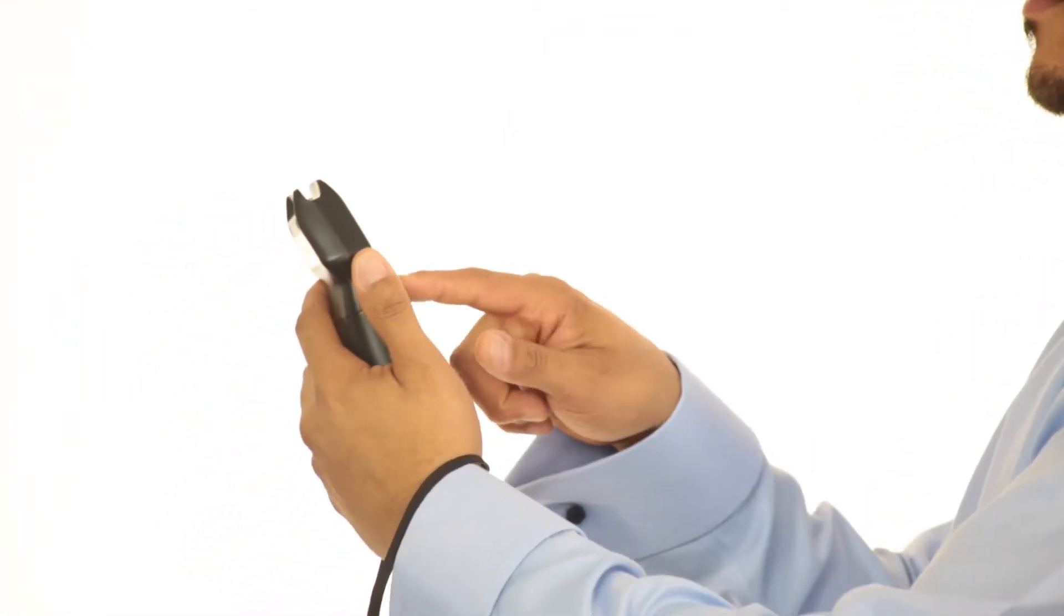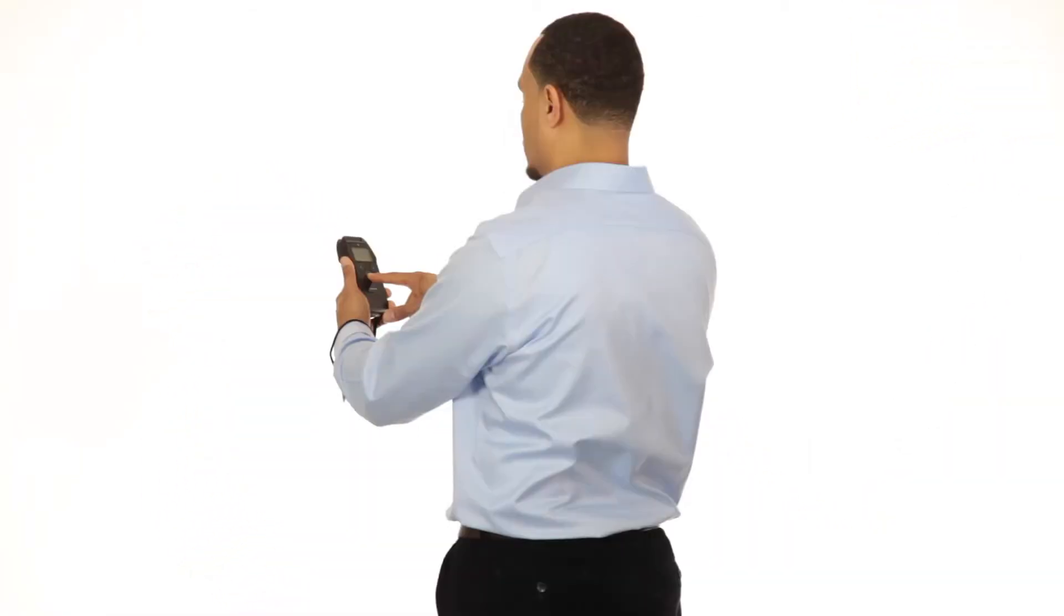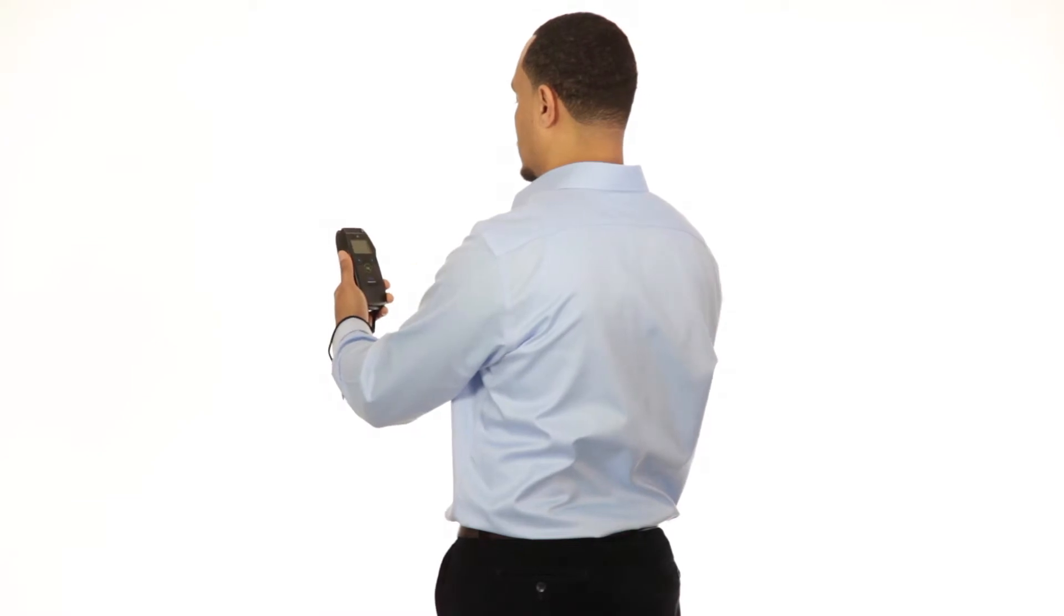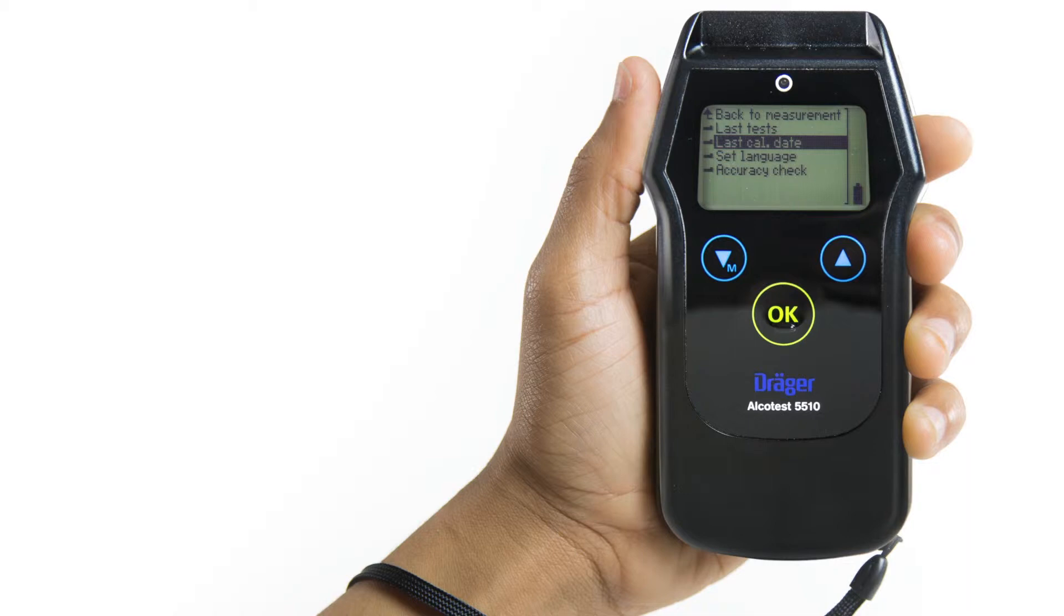Highlight the selected function using the up and down arrow buttons, then press OK. The quick menu options include Last Tests, Last Calibration Date, Set Language, and Accuracy Check.